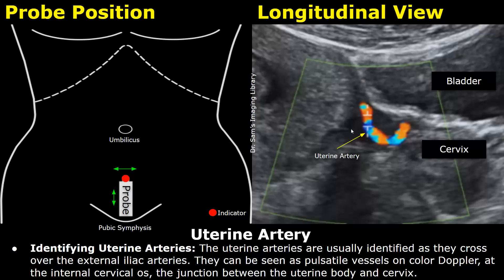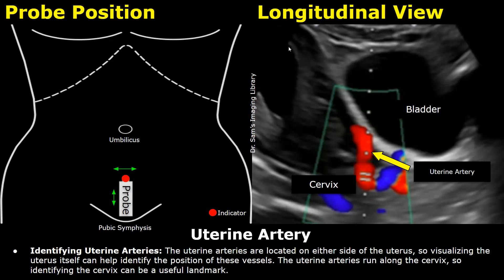When you apply color Doppler, you will find pulsatile vessels at this location — these will be the uterine arteries. You can start by locating the uterus first, then locate the cervix, and then focus on the area between the uterine body and the cervix. By applying color Doppler you will be able to find pulsatile vessels. These will be the uterine arteries; they run along the cervix, so identifying the cervix can be a useful landmark.